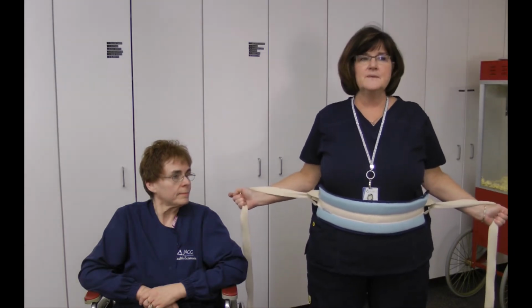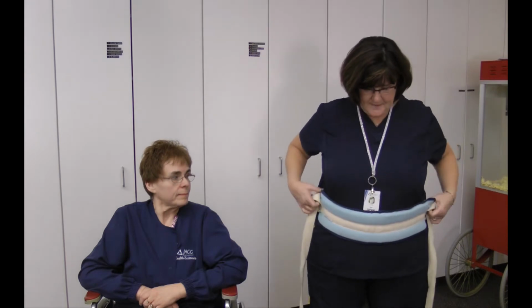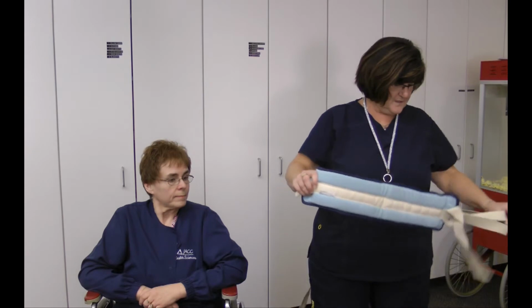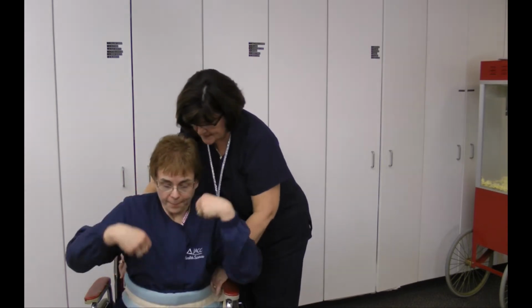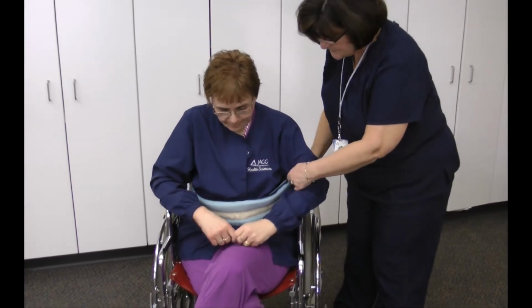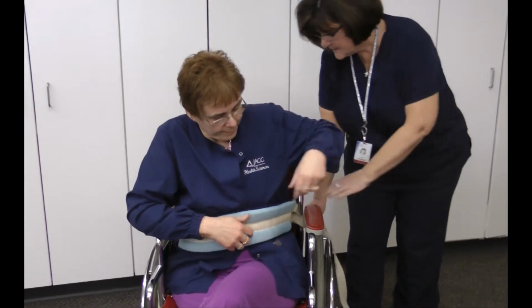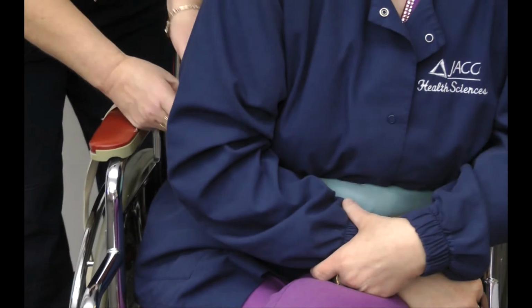I'll demonstrate this, but I want to make sure that you know how this waist restraint is being applied. Okay? It's so important if you're using one of these apparatuses that you do it the correct way. So Melissa, I'm going to go ahead and put this on your stomach. I'm going to ask you to lean forward. I'm just crossing it in the back, and I'm bringing it around to the side. I have to put it through the loop here. Get it comfortable. I have to put it through the loop here.